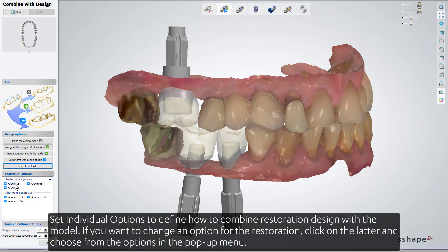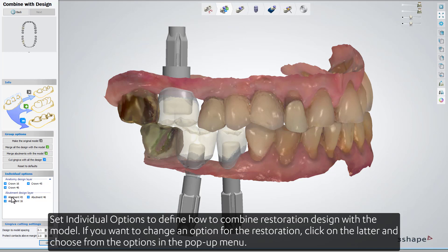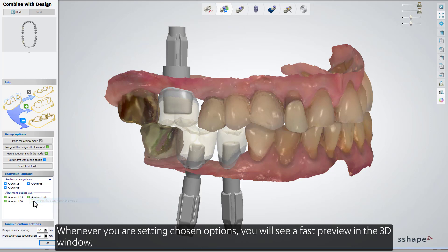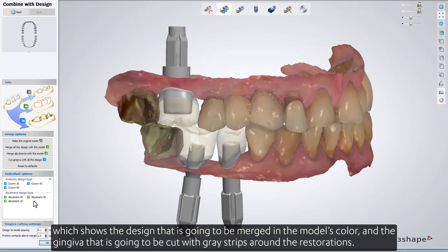Set individual options to define how to combine restoration design with the model. If you want to change an option for the restoration, click on it and choose from the options in the pop-up menu. Whenever you set chosen options, you'll see a fast preview in the 3D window.